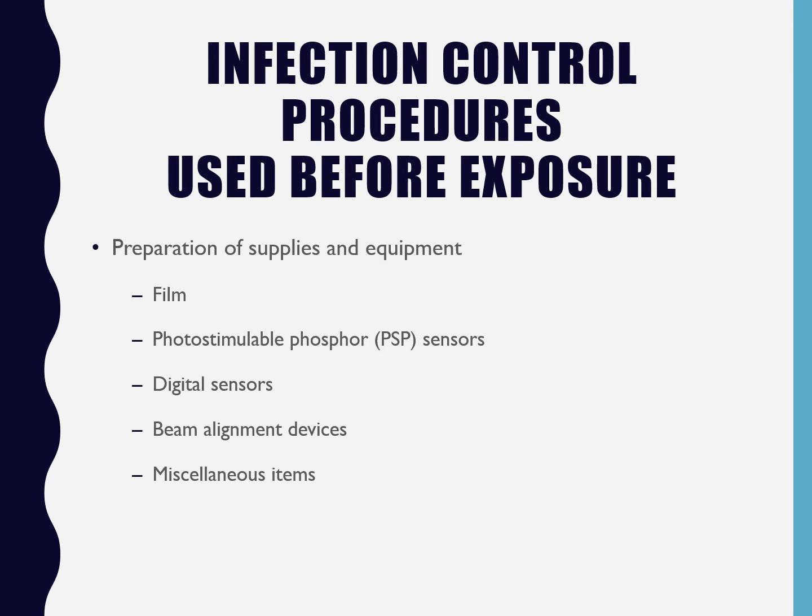You want all of these things ready before you seat your patient in the chair. So when they're in your operatory, you're telling them all of these things to get them ready. They're not going to bring their coat, they're not going to bring their purse, they're going to take out their earrings, things like that. And then once they come and sit down, they should have everything ready. You have all of your stuff already out. One, to prevent infection control, right?